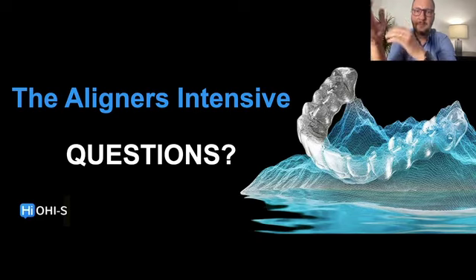I showed you that even though most companies accept the basic documentation for orthodontics and it's okay for them, most of the time they are leveling the model with the horizontal line of the floor, and then we lose a lot of reference about the natural head position, okay? So I don't use a fancy camera for photography, okay? I use a regular camera, sometimes even my smartphone, my iPhone, okay?